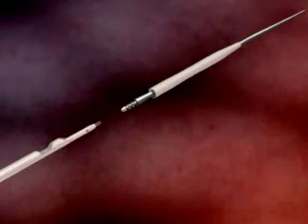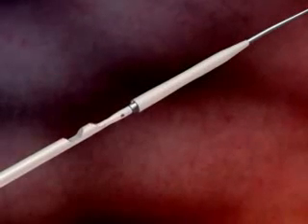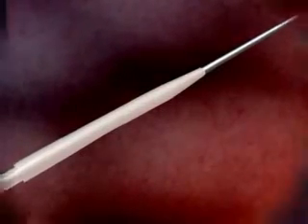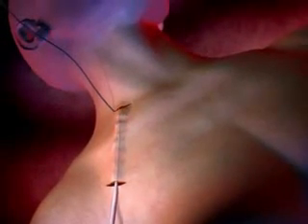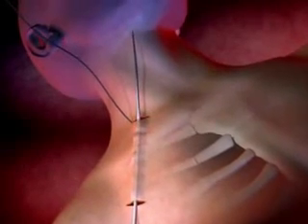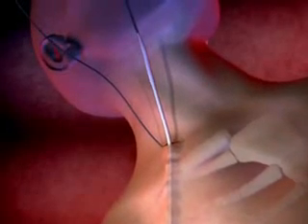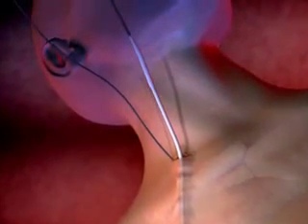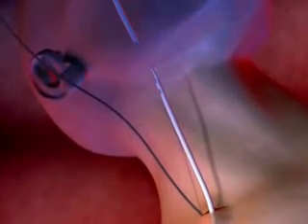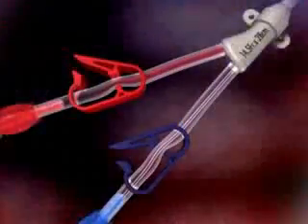Pull back the stylet tip into the catheter and attach the catheter to the tunneller. Slide the tunneling sleeve over the catheter so it covers the arterial hole. Insert the tunneller into the hub exit site and pull the tunneller and catheter through the subcutaneous tunnel to the venous insertion site. Do not tunnel through muscle. Gently lead the catheter-tunneller connection into the tunnel. When tunneling is complete, remove the tunneller from the catheter. Do not pull the tunneller out at an angle. Keep the tunneller straight to prevent damage to the catheter tip.